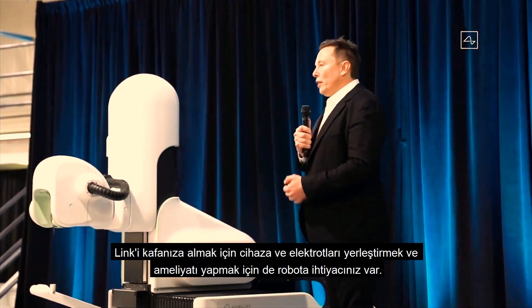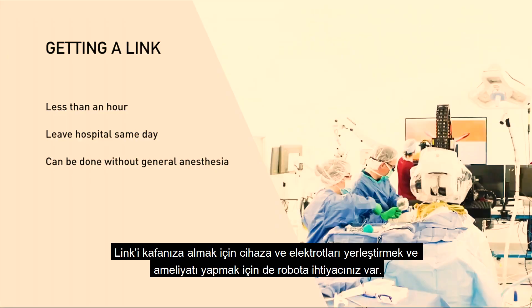In terms of getting a link, you need to have a great device, and you also need to have a great robot that puts in the electrodes and does the surgery.